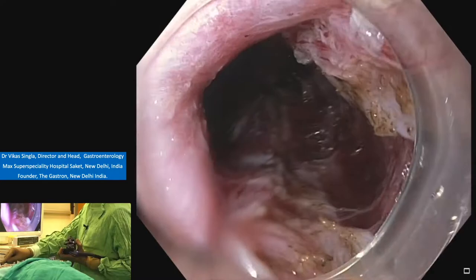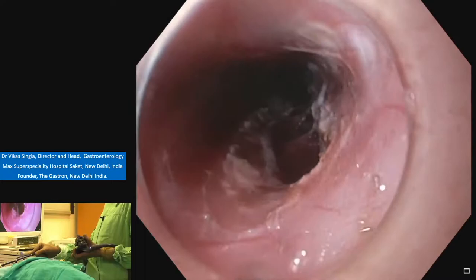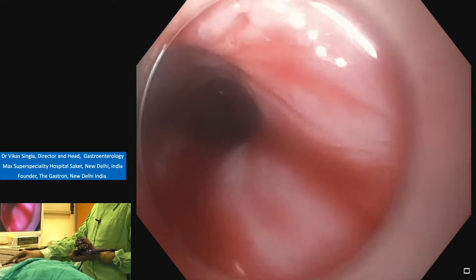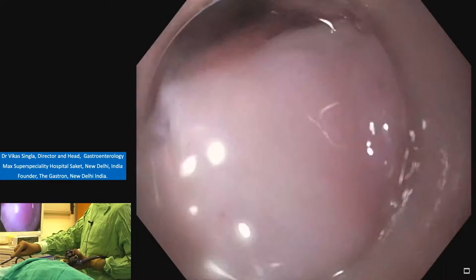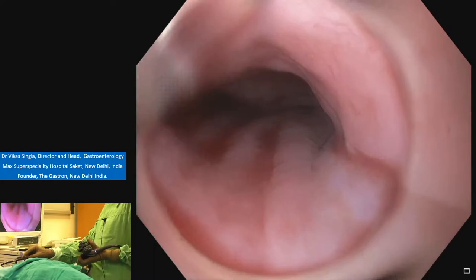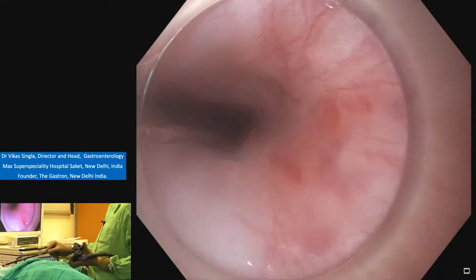So this is type 2 achalasia cardia. This patient should have relief of symptoms after the POEM. Blood in the esophageal side also. So the blood has likely come out of the tunnel into the esophageal lumen. It opened up the GE junction. Would clean the lumen. Again, let's clean the lumen and then we go again.